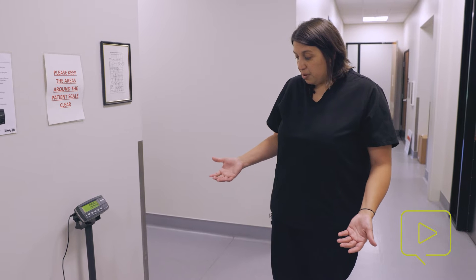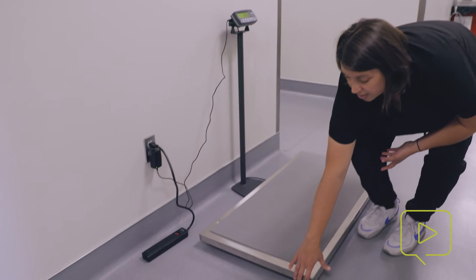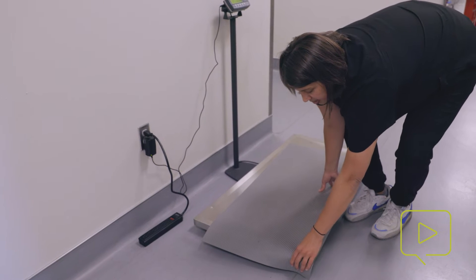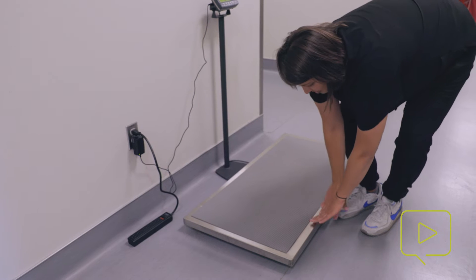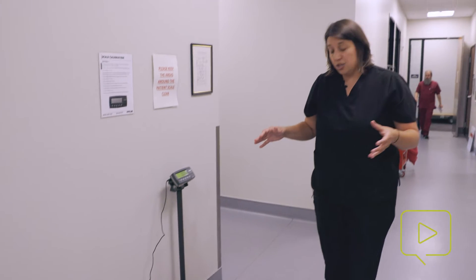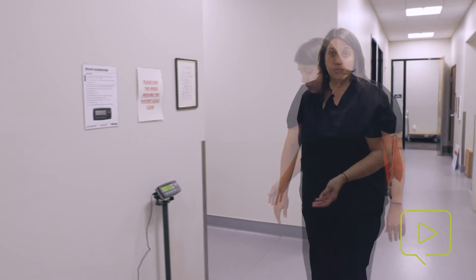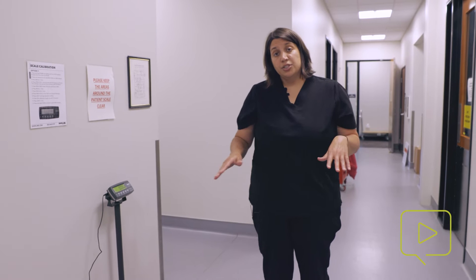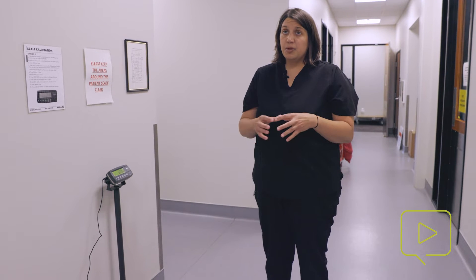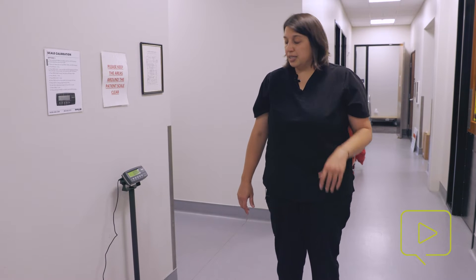Other things that can be problematic with scales: if a cord gets stuck underneath and is making it not be on level ground, or if your mats go off the edge, or if the animal is sitting on the edge of the scale, you can get some inaccurate weights. It's most important that you have an animal that sits in the center of the scale, sits still for a moment, and then you read your number. We also have scales that are flush to the ground here at Dove Lewis, and we use those for gurneys. If you're putting a gurney on the scale, it can be easy for the wheels to get off of it, so it's important to turn the wheels inward and make sure they're fully on the scale.